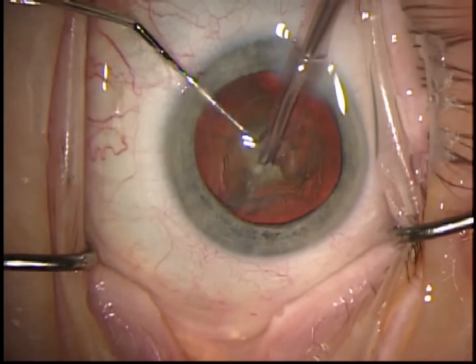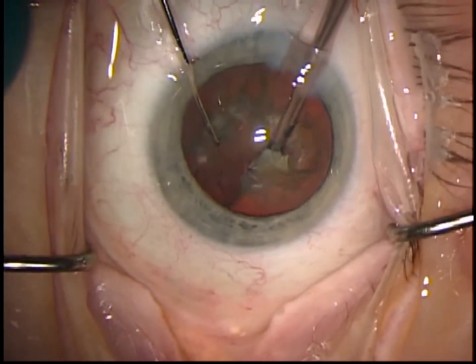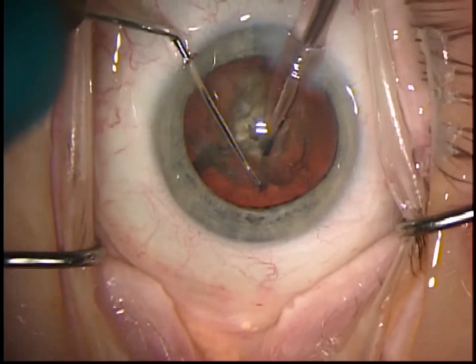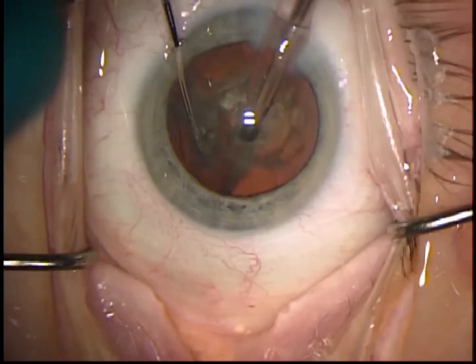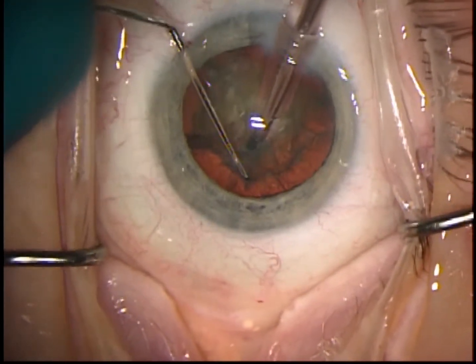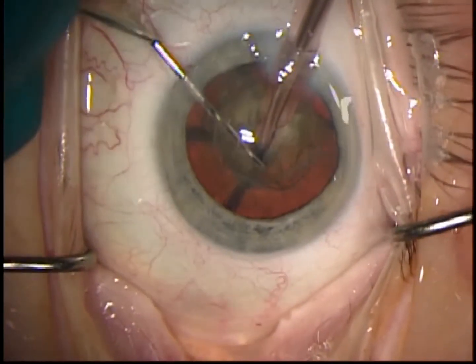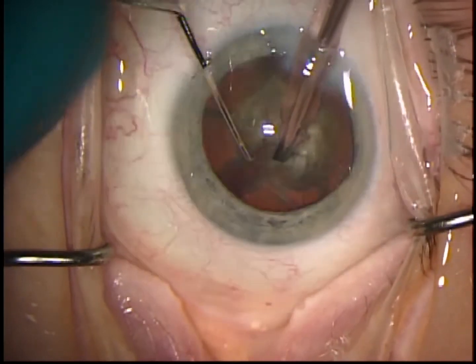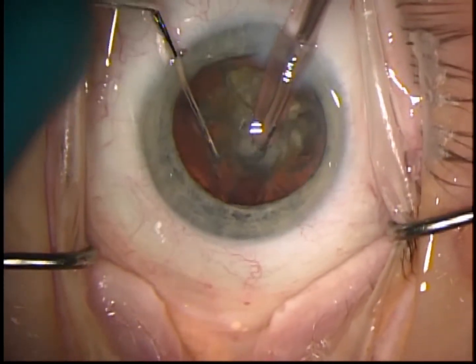I've cleaned up most of my cortical material. Dive in with a steep angle of attack with the faco tip, and drop the second instrument into the nuclear material. You can see that I pull to the side, and I'm maintaining the nucleus centrally. So essentially, I'm holding the nucleus with my faco tip, not allowing the entire bag to move. And then I drop my second instrument again into my anticipated spot where I'm going to chop next.